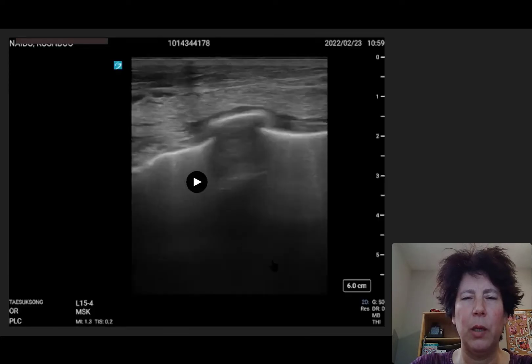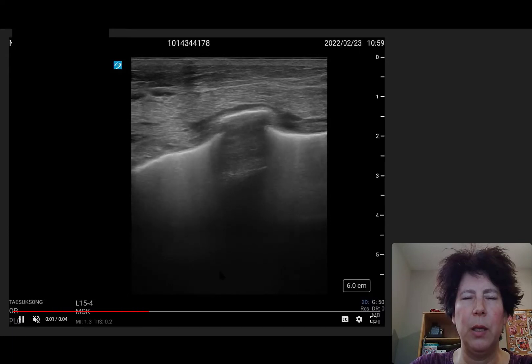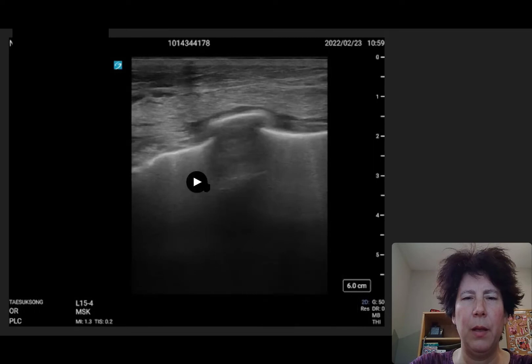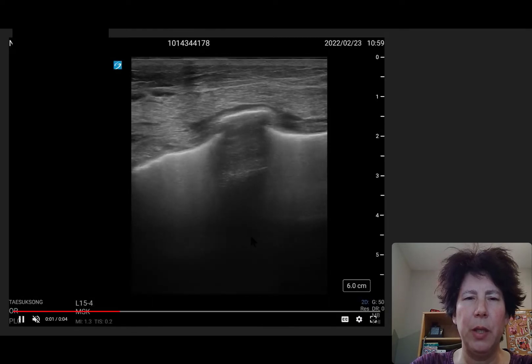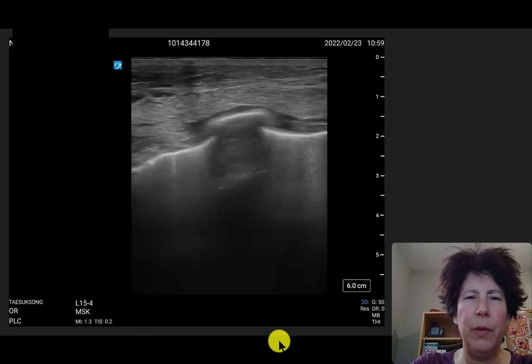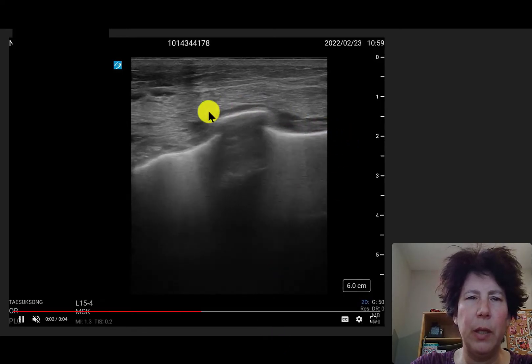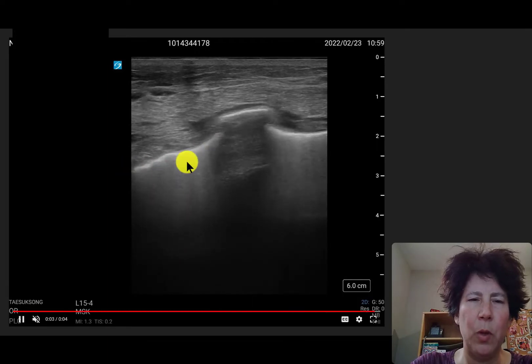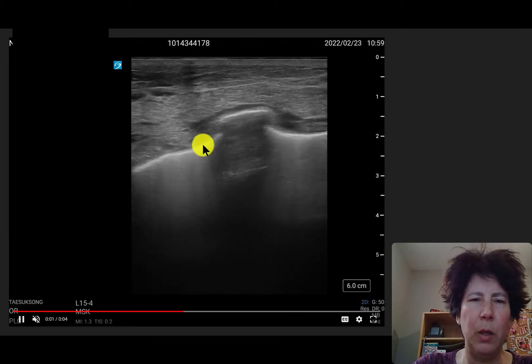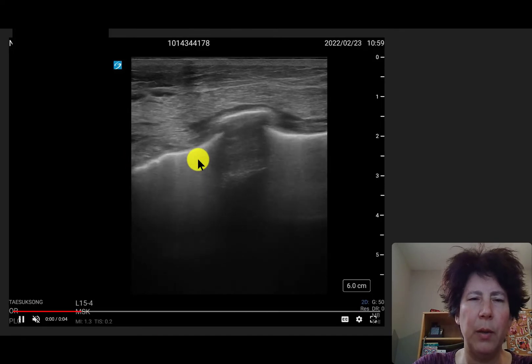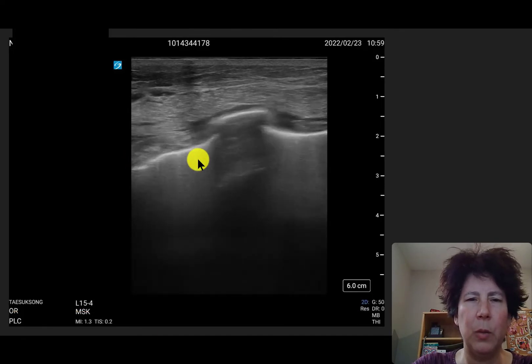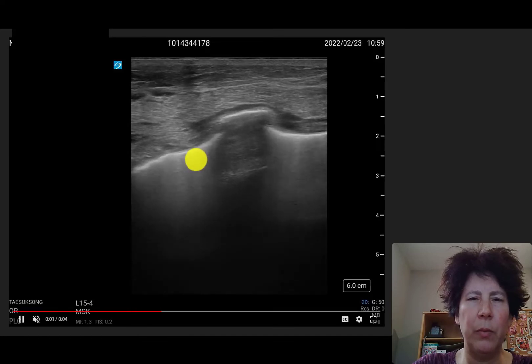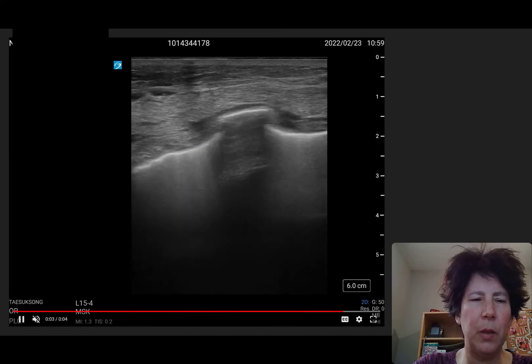The first images we saw were these, and my first impression is just that there's really a lot of fluid here. You can see fluid lines in the tissue, and then these lung confluent B-lines with not a lot of movement on the pleura. So kind of difficult ventilating, not a lot of flow movement — a lot of fluid there.